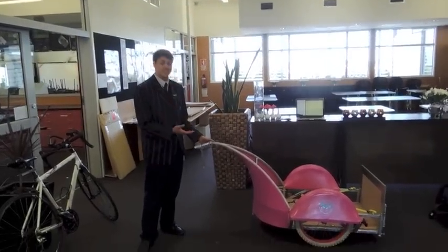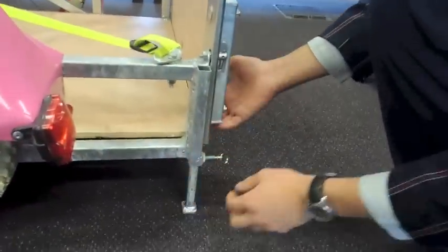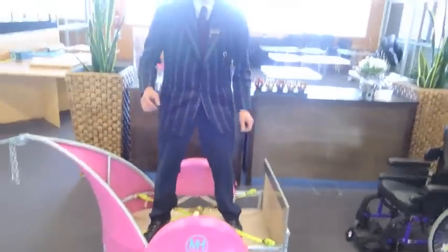Hi, my name is Martin and this is the Chariot. Let's get started by setting it up on its props. All you need to do is pull the spring-loaded pin and it locks securely in place. As you can see, the three-point design is very stable.